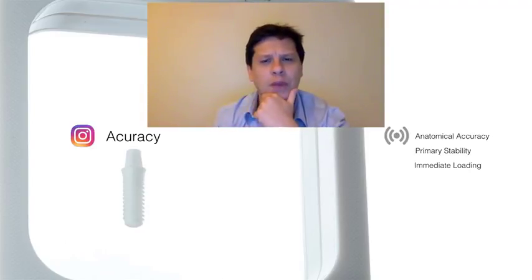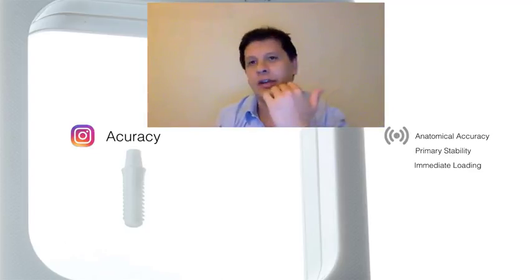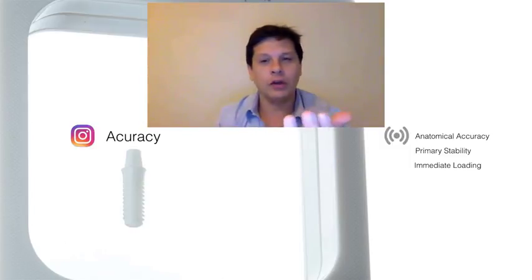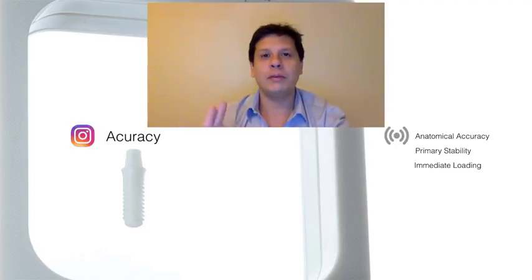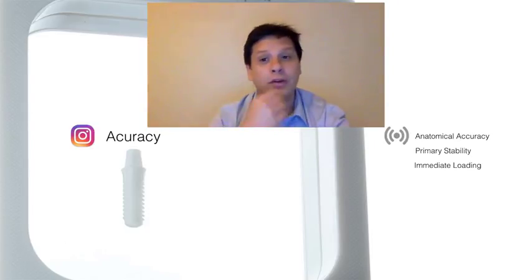a very difficult situation. Now, I've seen implants being placed too buccally, leading to recession, and the patient comes with an osseointegrated implant, but with a bone defect that becomes harder to solve. So in these types of situations, the best thing that you can do in treatment planning is to hit it the first time. If you hit it the first time, you avoid later problems for the patient.